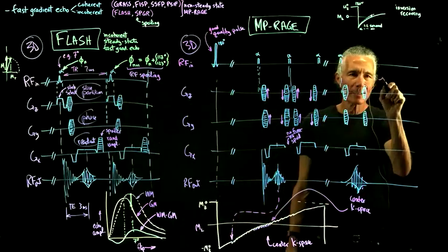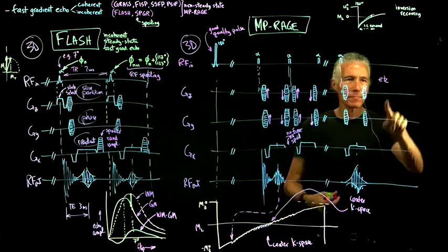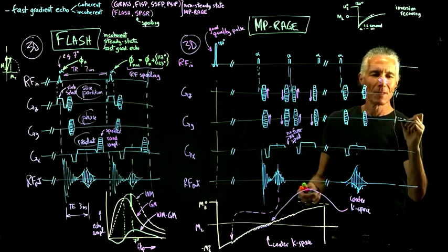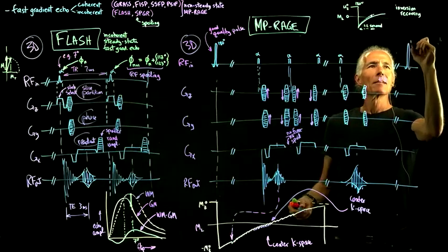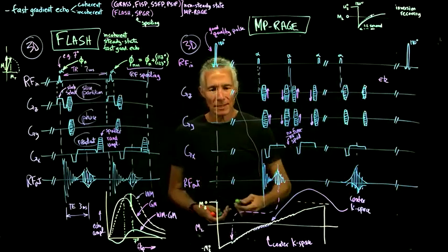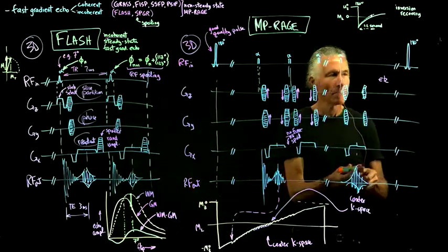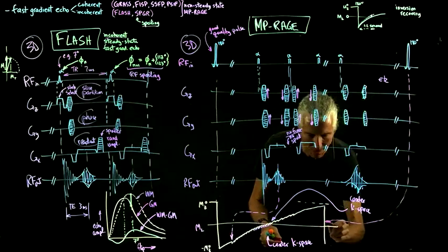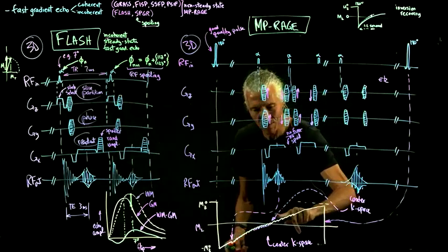But then we're going to do, et cetera, collect some more until finally we get back. So there'll be more collection there. You can see the board isn't big enough. And then eventually you get back to another 180. So here's another 180. So the way that this pulse sequence and that this guy corresponds to here, the way that this is notated in the interface is kind of confusing.